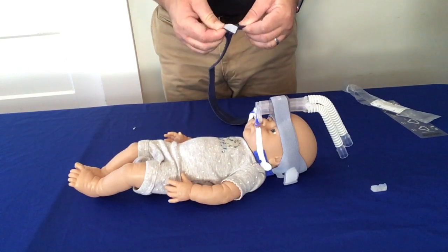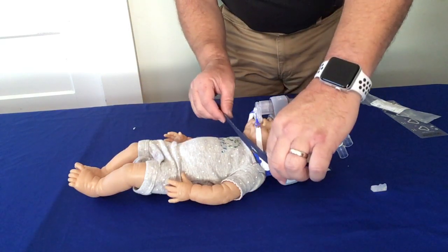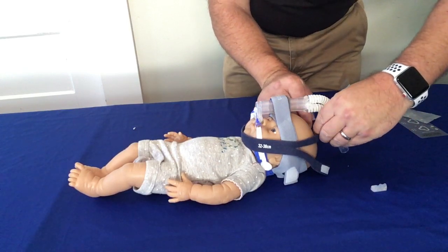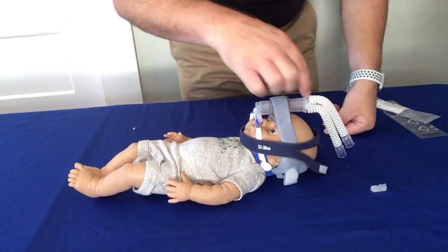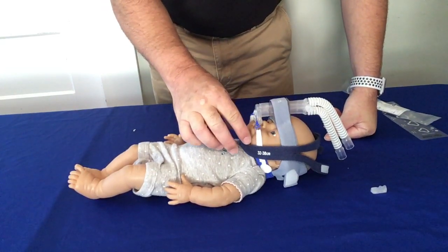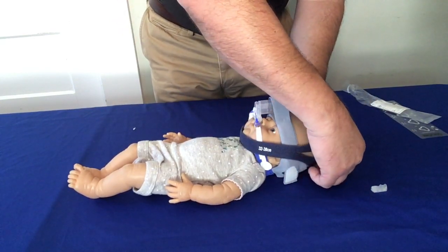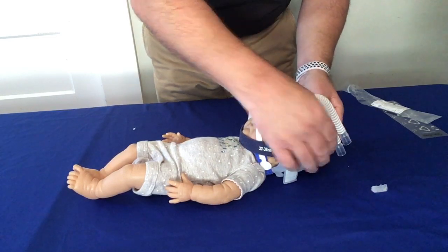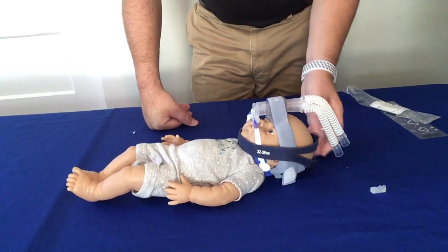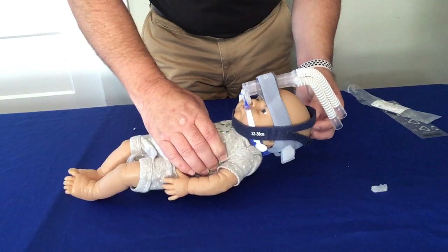If you'll notice, the chin straps do have two splits on either side. That's designed there for a reason. You want to go ahead and tuck the chin strap under the baby's chin as if the baby has a toothache. And then notice how I only cover the exact amount of the Velcro without overextending. We don't want the gums to touch, we just want the tongue to fill the roof of the mouth. So we're not trying to keep the baby from yawning, burping, or regurgitating. Those are all things the baby might have to do. We're just here to help suggest for the baby to close the mouth.